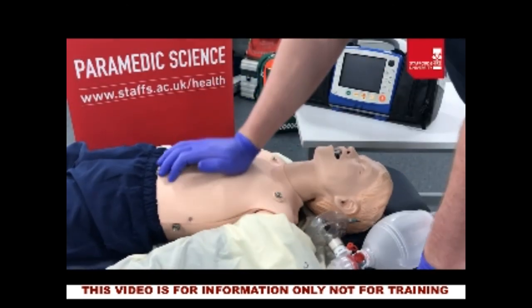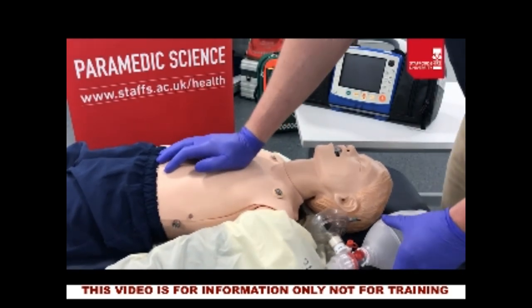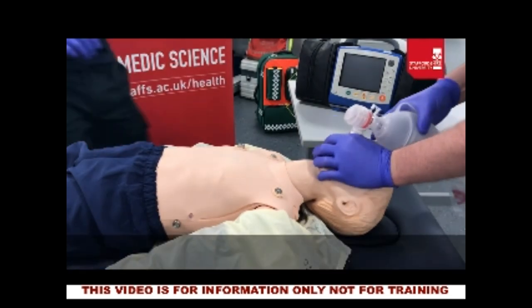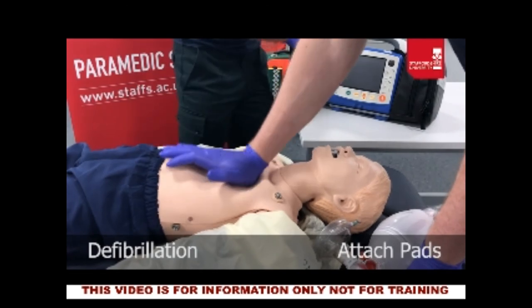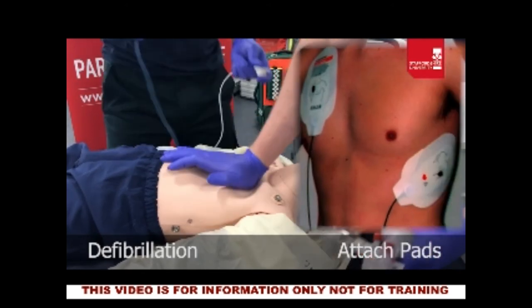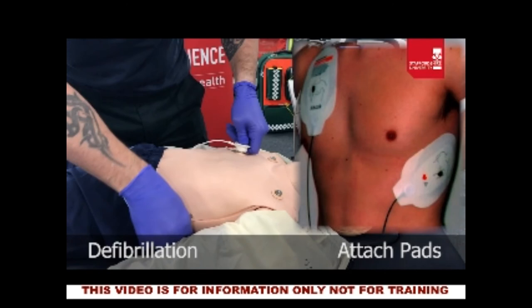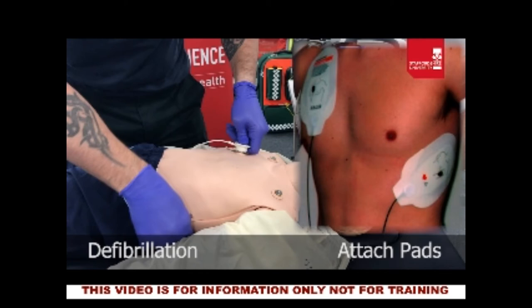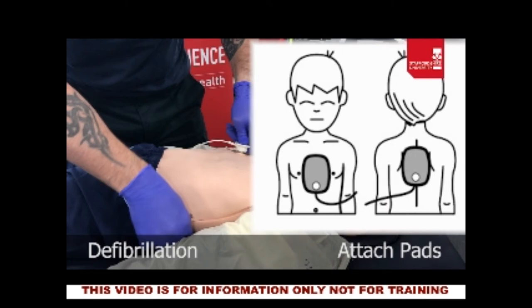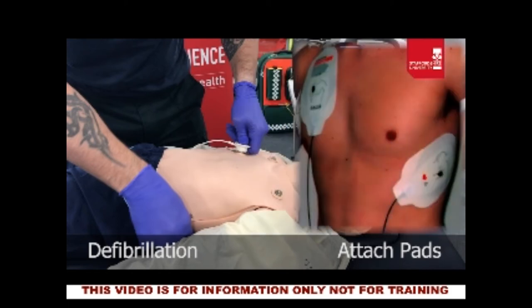It is at this point in the OSCE that we move from BLS towards the ALS side of things. Your crew mate joins you on scene and you ask them to attach the pads. Pads must be attached correctly — the correct placement is shown here. This placement assumes a patient size that can accommodate pads in that location. If the paediatric patient is too small, you need to alter pad placement — potentially placing one pad on the chest and the other on the back directly opposite.